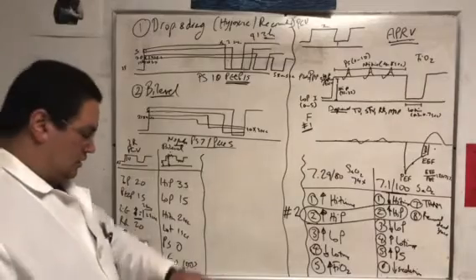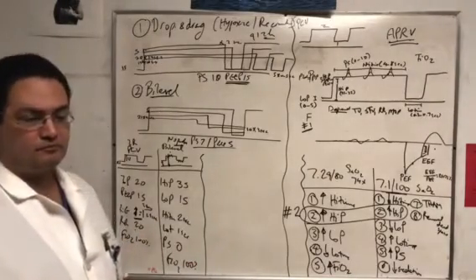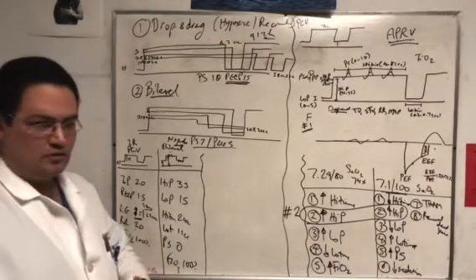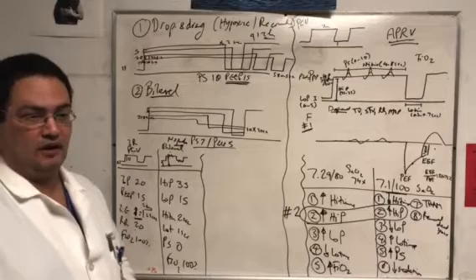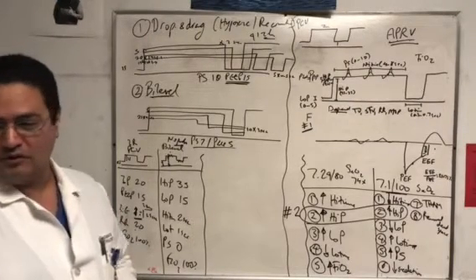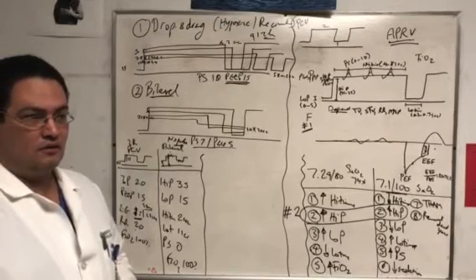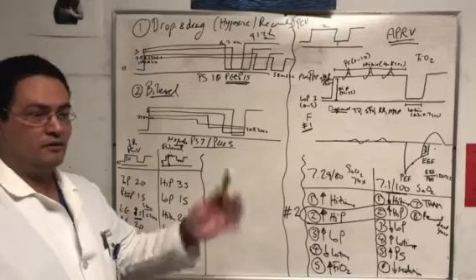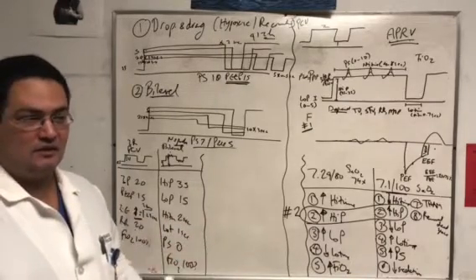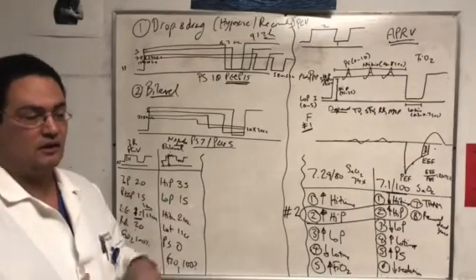And then, of course, another hindrance to starting this process is, when you graduated from medical school and went to the first shift and they said, hey, what do you want to put this patient on? Coming from the ER or something, intubated, what do you want to put the patient on? Volume control 512, 5 PEEP and 100%, like easy. You can spit it out easily. Here, if you don't know the settings and it's not ingrained in you, you're not gonna do it, right?